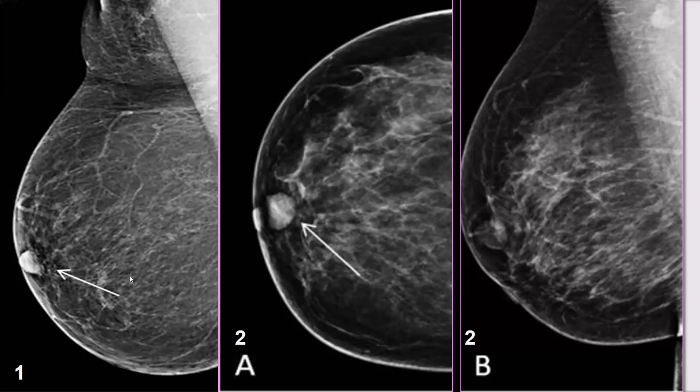Did you attend the discussion of the first image? I came late, Sarah, but I saw the first one described. We said that the lucent halo should be surrounding the nipple from the lateral sides, excluding the medial side. So in the other image, I think this is not the nipple. Yes, excellent. Because the lucency does not surround it. I could see the nipple first, and there is another part, another opacity seen posteriorly. So what could it represent? It could represent a focal asymmetry.